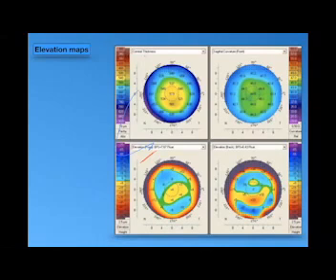Again, +15 is a point of acceptance. Some authors said that +18 is the margin of acceptance in the myopic and +21 in hyperopia. But actually the margin from +15 to +21 is highly suspicious in both, but it could be accepted in the hyperopic more than the myopic, especially if the other points are within normal and there are no other risk factors in this patient.